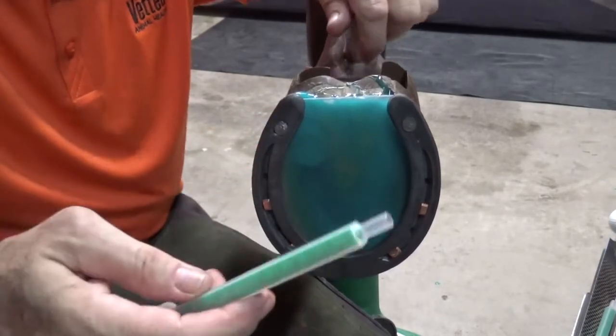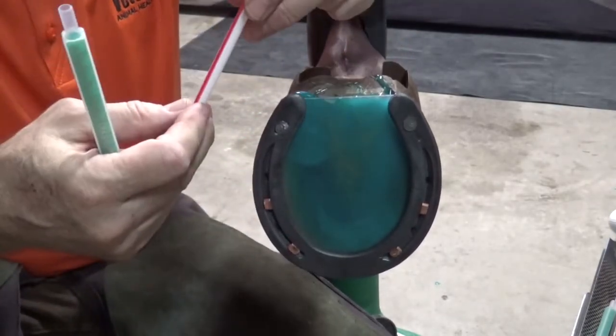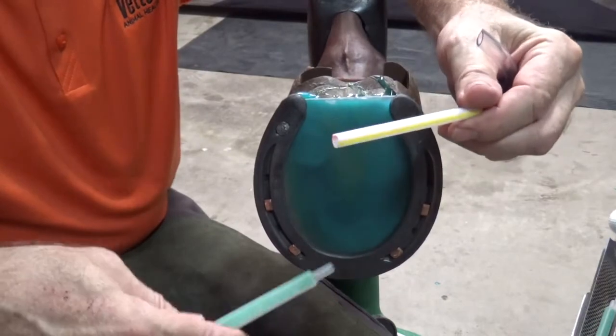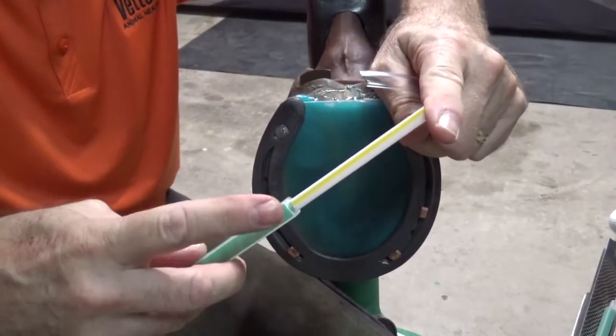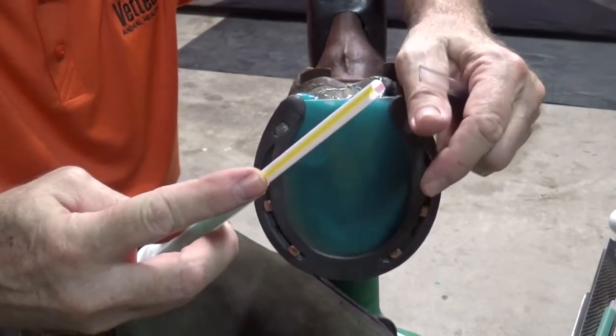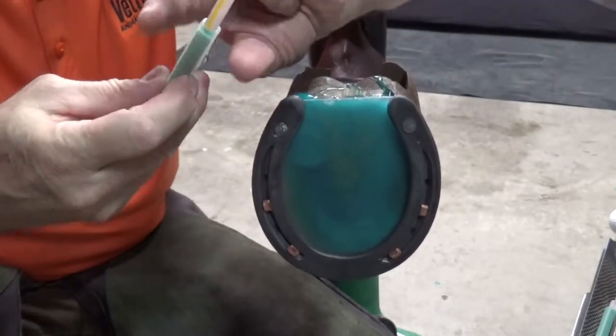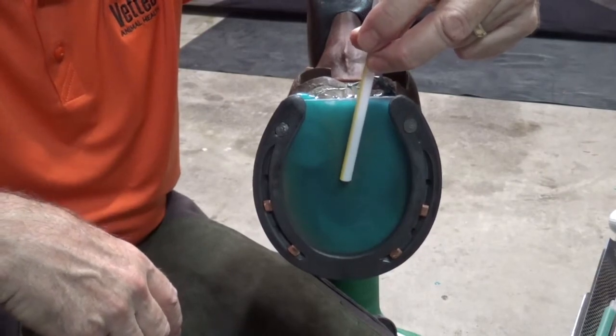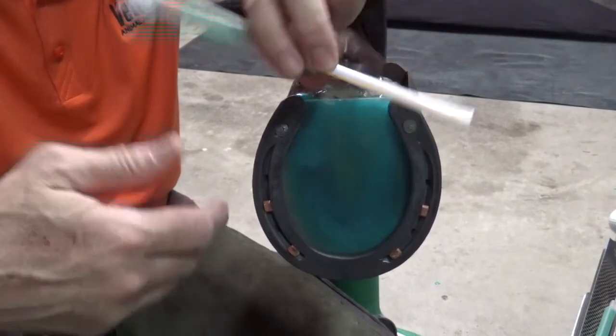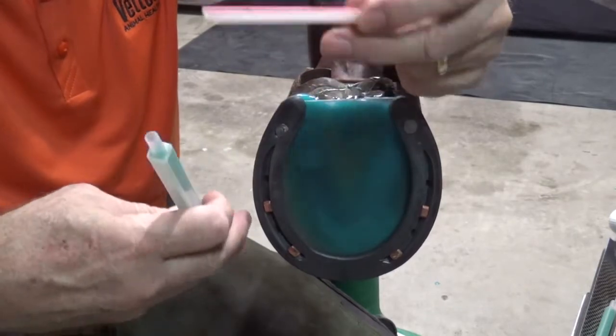Here's a couple other things that you can do. This is a McDonald's straw, which happens to fit over the end of this mix tip. You just need to put a little piece of duct tape on there to hold it on, and that way you can insert that under the pad and back it out as you fill. So that's one option.